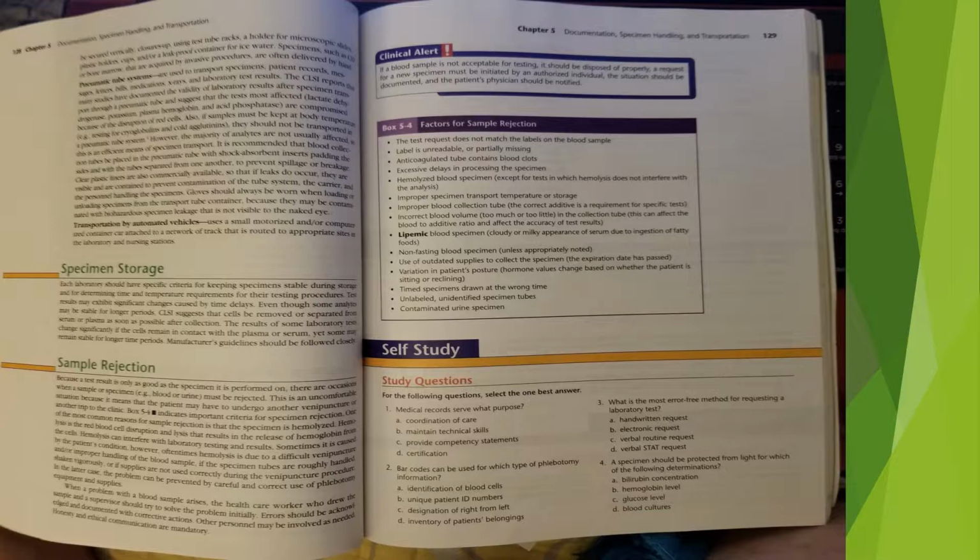Test results may exhibit significant changes caused by time delays, even though some analytes may be stable for longer periods. CLSI suggests that cells be removed or separated from serum or plasma as soon as possible after collection. The results of some laboratory tests change significantly if the cells remain in contact with the plasma or serum, yet some may remain stable for longer periods of time. Manufacturer guidelines should be followed closely.